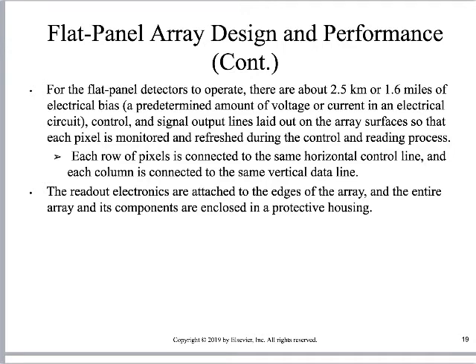All that I would think about this as being like is a bucket brigade, right? So imagine that this room was full of water. We stored all this water in this room, right? One of the most efficient ways that we could drain the water out of this room would be to partition the room in rows and then just have a bucket brigade that empties out each row, right? That would be one of the most efficient ways we could drain this room. That's what this thing's doing. It's throwing the bucket brigade at all that electricity.